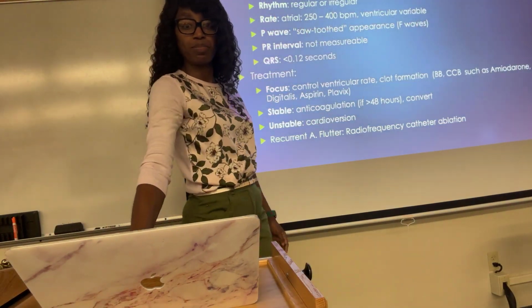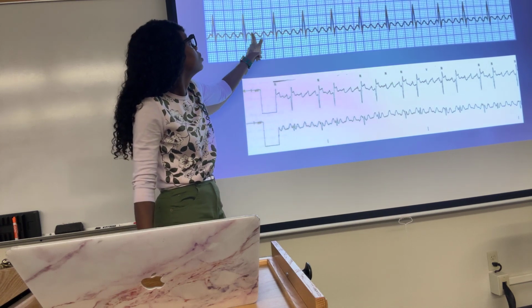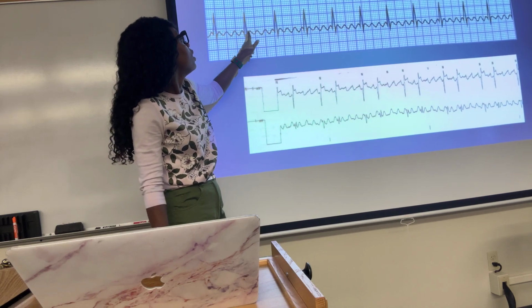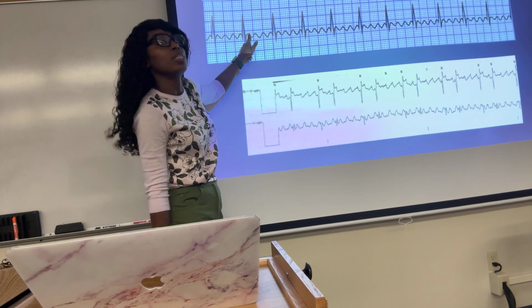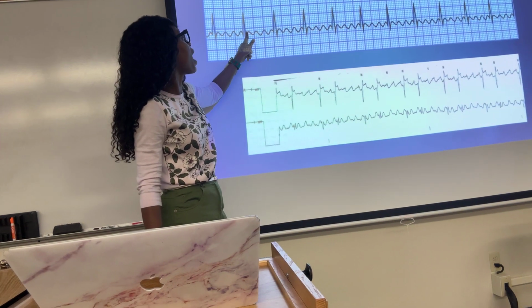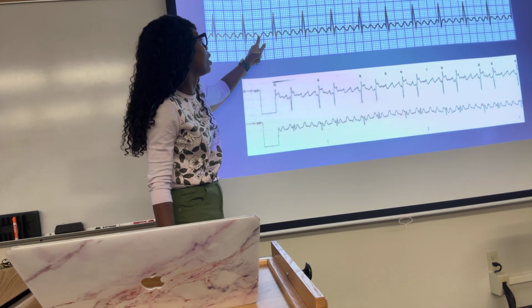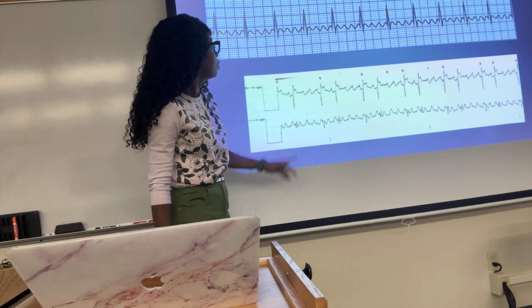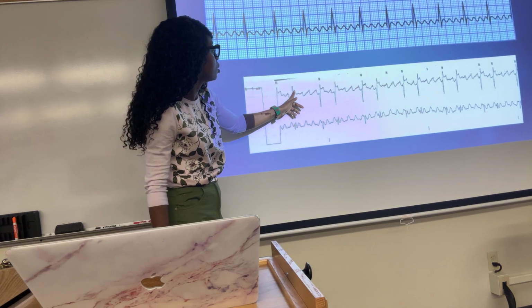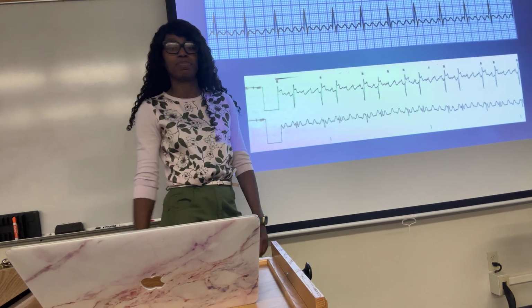So because it's atrial, those are all P waves? Yes, these are all P waves. And there's no T waves. Or is it that one's hit, the last one's hidden, and then the other ones are P waves? Exactly. It's hidden. So this can possibly be a P wave, the T wave, but it can also start the P wave. Like this T wave is up here, and then these are the P waves.